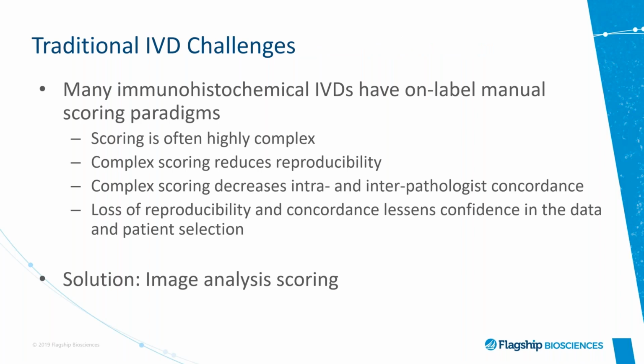So, many immunohistochemical anti-PD-L1 and PD-1 IVDs are on the market, and those are associated with on-label manual scoring paradigms. This scoring is often highly complex.